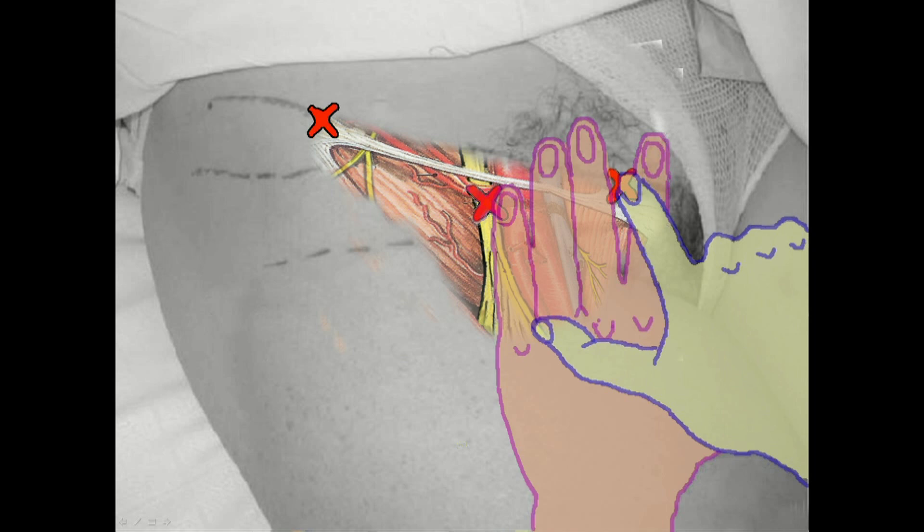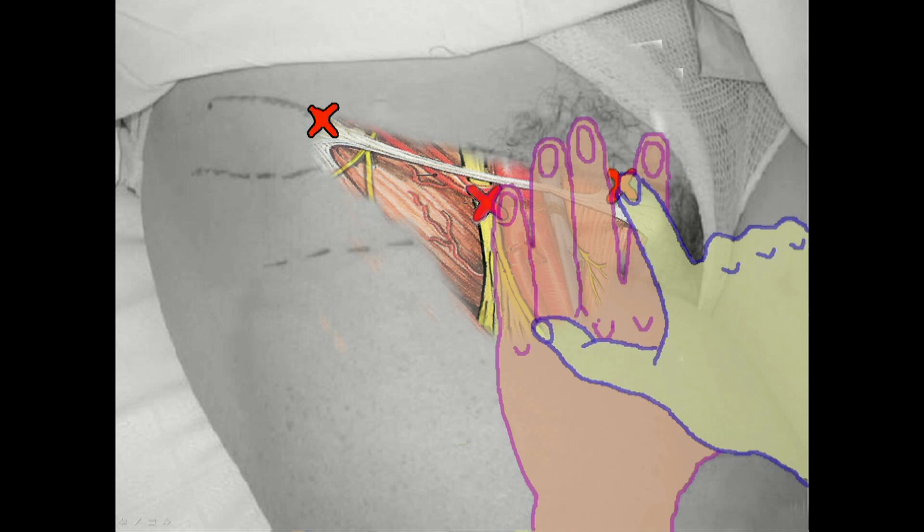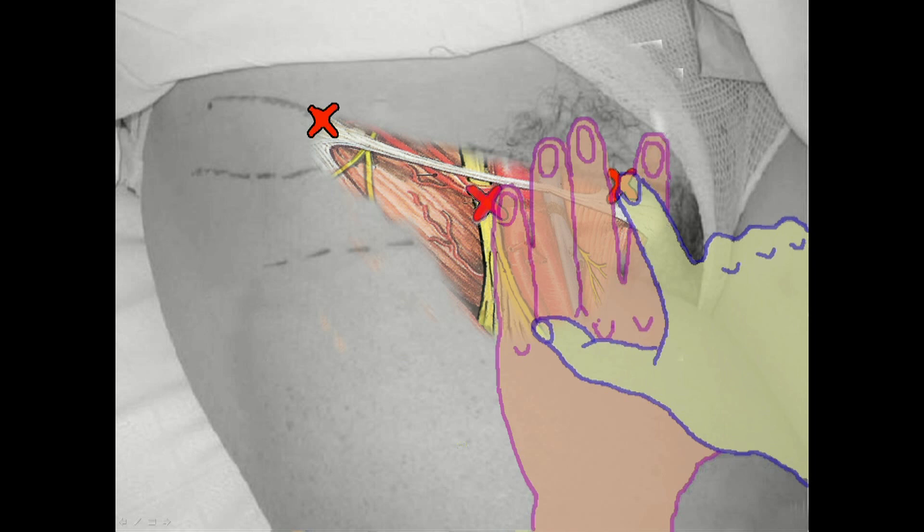It is possible to misidentify the anterior inferior iliac spine, especially in thin patients, as the anterior superior iliac spine, if one does not specifically seek the supramedial aspect of the anterior superior iliac spine. Also, if obesity and redundant hypermobile abdominal tissue makes marking the anterior superior iliac spine difficult, it is sufficient to only use the pubic tubercle as a reference point. In hyper-obese individuals using electrostimulation techniques alone, the pubic tubercle may be the only possible identifiable landmark in the region.